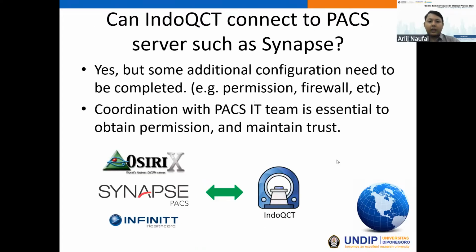And next, can IndoQCT connect to a PACS server such as Synapse or Infinitt or OsiriX? The answer is yes. However, some additional configuration also needs to be completed, such as permission, firewall, and many more. So in this case, coordination and communication with the PACS IT team is essential to obtain permission and maintain trust.